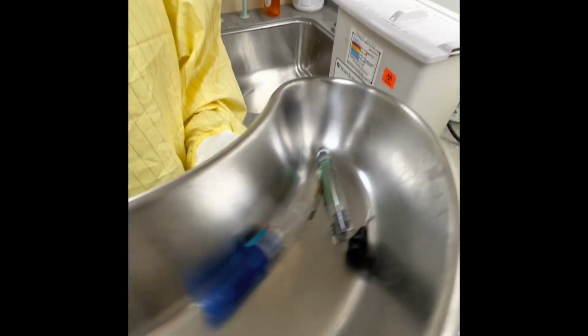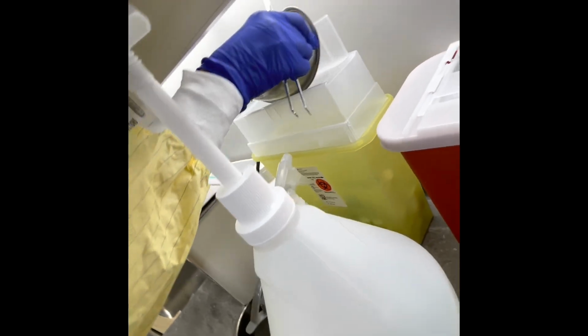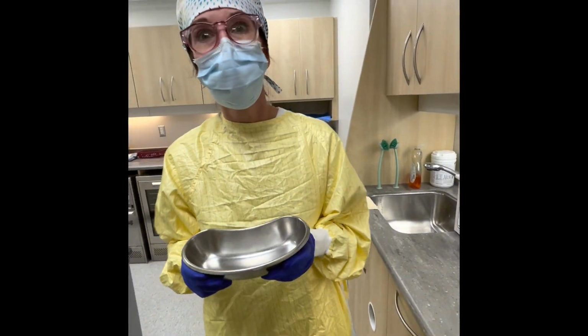Now the rest, so that I don't have to touch them, I'm just literally going to take my kidney basin and dump it. Okay, I'm going to make sure that everything's out of there. And now I'm going to head back to my unit and start cleaning and disinfecting.